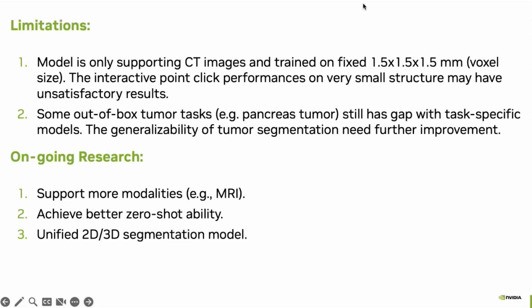So the last part is the limitations. Currently, the model only supports CT images because our goal was to first develop state of the art for one modality, and then expand to more modalities. And we trained the model on a fixed 1.5 millimeter resolution.